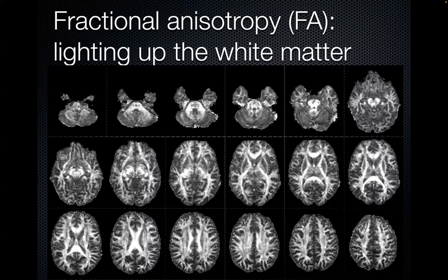And suddenly the FA is like 0.1 or 0.2. Because two large highways with FA of 0.8 are actually crossing there. And it leads to an FA of 0.2 or 0.1. This is not pathology. But this looks like an MS lesion. If you look at multiple sclerosis, a lesion would actually have this signal. So we need something a little bit better.